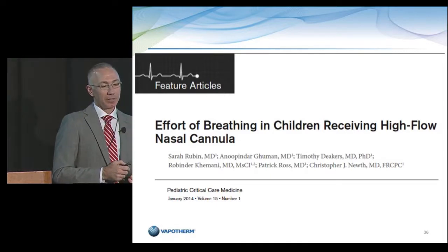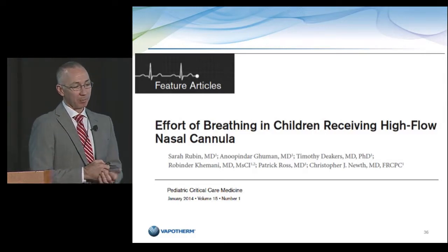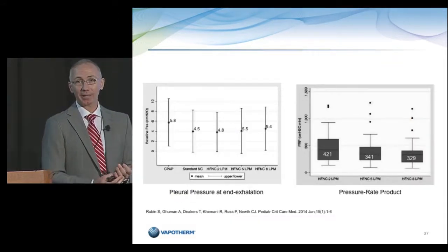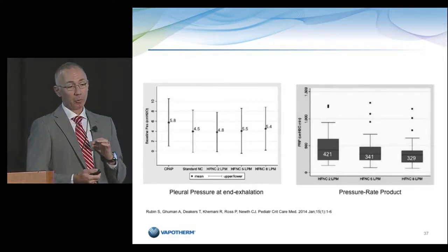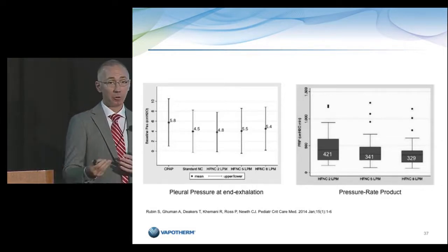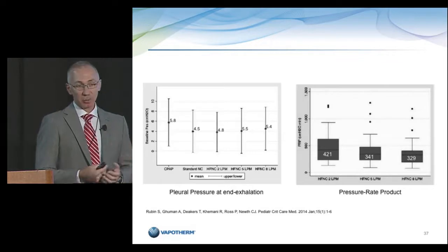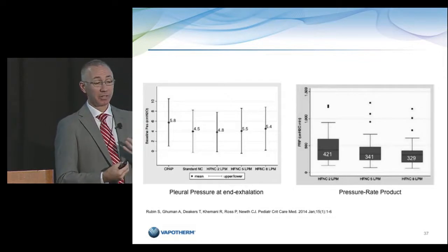So patients were ventilated, and just prior to extubation, they were placed on CPAP mode on the ventilator, and what you see over here, a pressure of 5.8 centimeters of water, is the pressure that was being applied via CPAP to those patients. Patients were then extubated with the probe in place, and they were randomly assigned to various flows of low flow and high flow therapy. And what they saw was that just by the application of a simple nasal cannula, the measured pressure was 4.5 centimeters of water. That's the esophageal pressure on those patients.